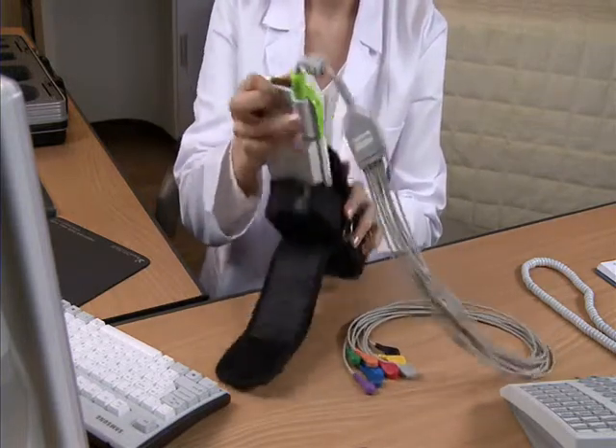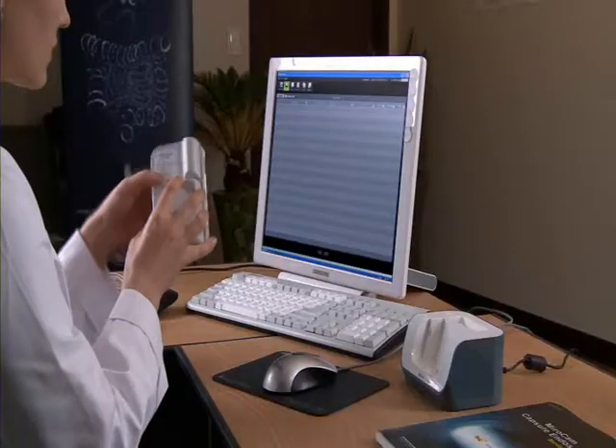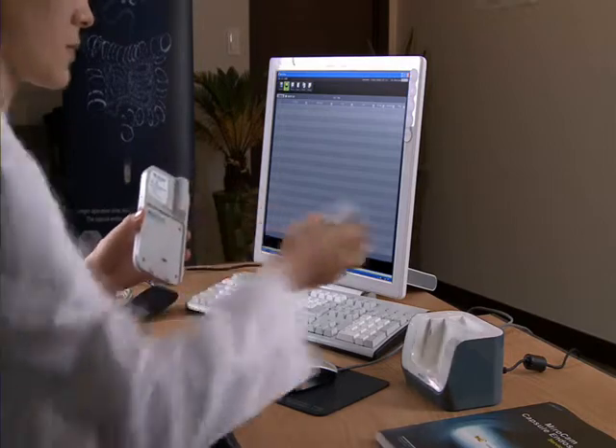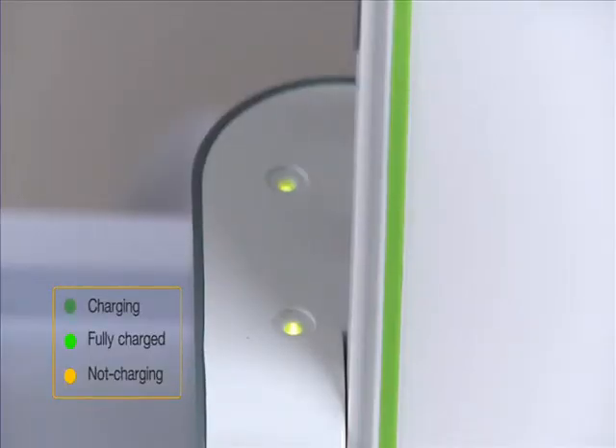Take the receiver unit out from the receiver bag and detach the data cable from the receiver. After detaching the battery from the receiver, place the battery in the charger. The battery must be recharged after every procedure. Battery charging will take approximately 4 hours.